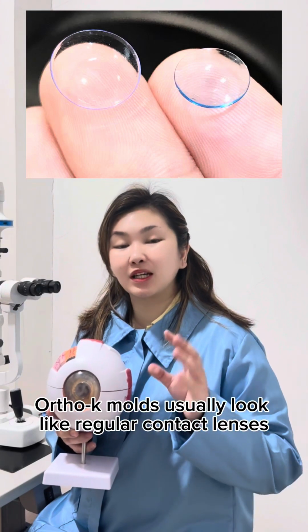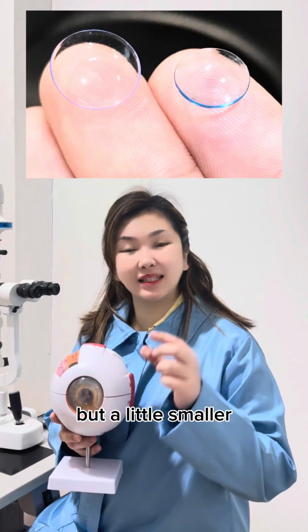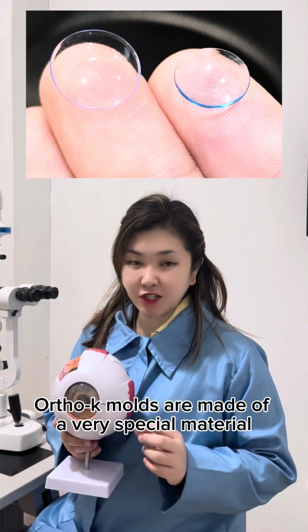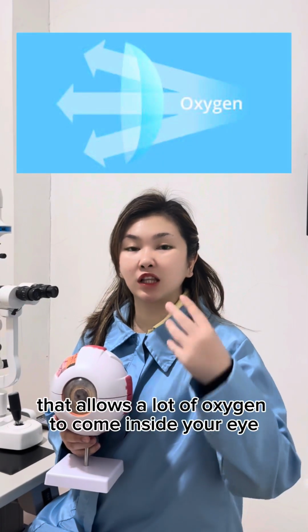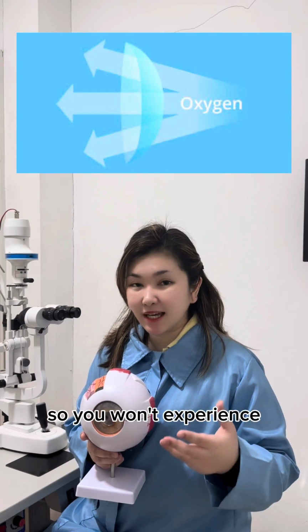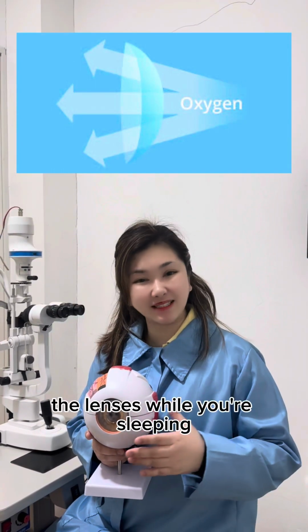Ortho-K molds usually look like regular contact lenses but a little smaller. Ortho-K molds are made of a very special material that allows a lot of oxygen to come inside your eye. So you won't experience any complications from wearing the lenses while you're sleeping.